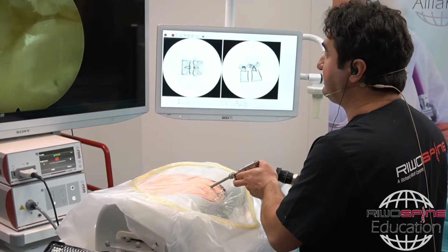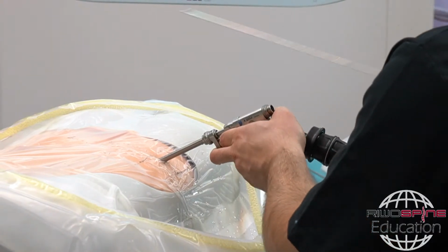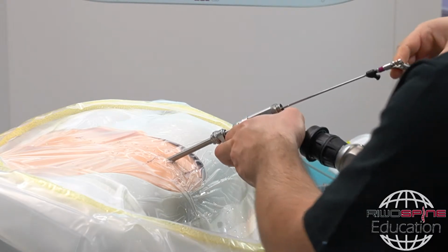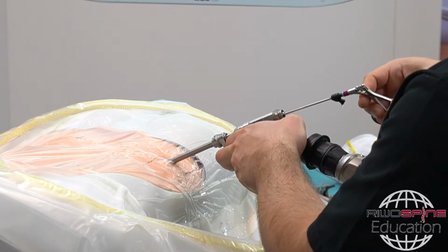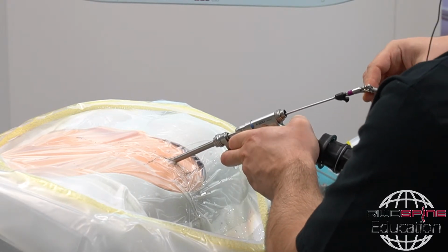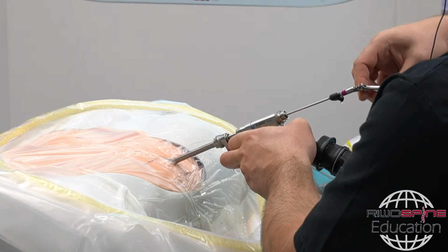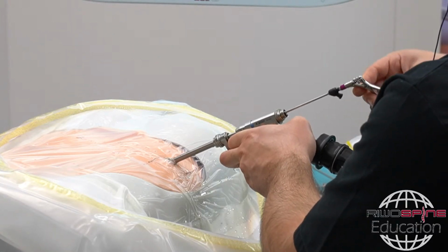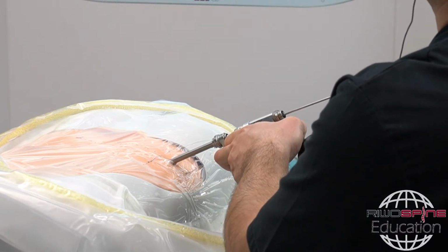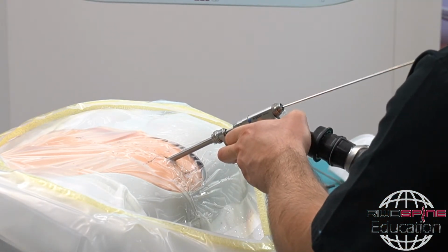But in this case, I would like to show you where the traversing nerve root is. Okay, I don't want to lose too much time to resect that herniation. I think it's clear how to do that. Maybe I would like to give some time for the discussion. And then if you go above this and remove that fat tissue, here definitely you will see the traversing nerve root in front of you. It's here in the back. You see? The white tissue is there. I mean, this one is the traversing nerve root, or the dura.